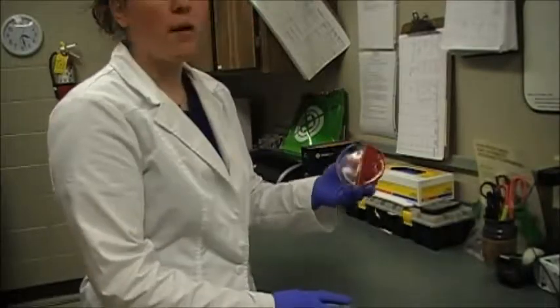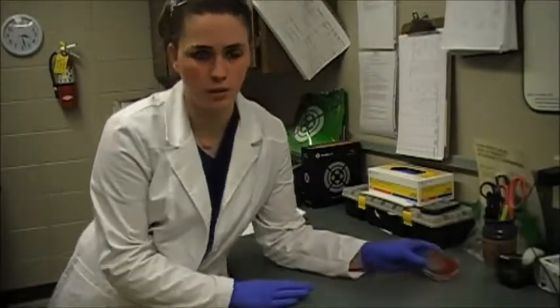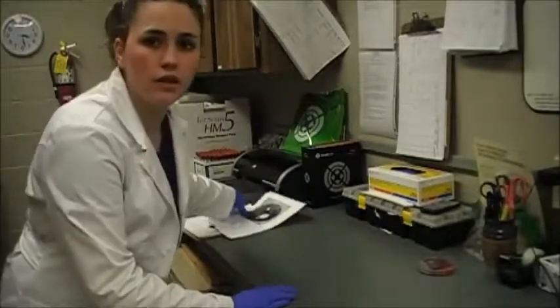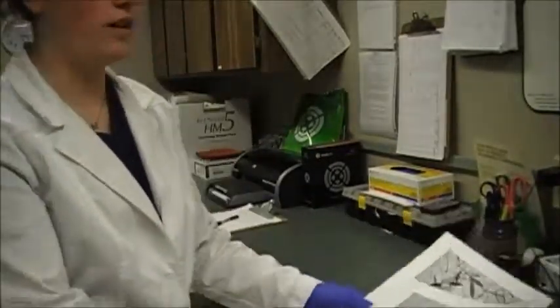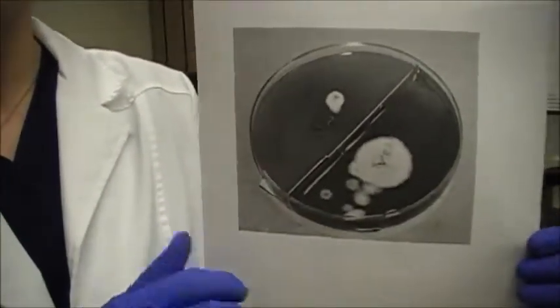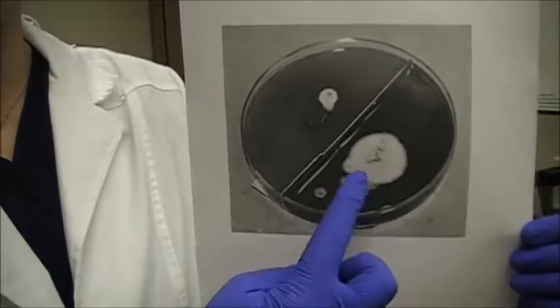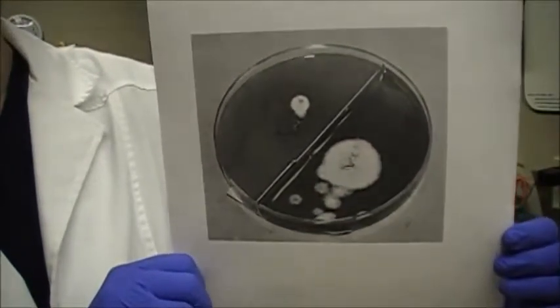If it were to be a positive test, it would be fairly obvious appearing on the medium. Since this has been incubating for several days, we've confirmed that it is not a dermatophyte or ringworm. What we'd be looking for on the test — this is what it would look like in our culture if it were a positive. It's a little harder to see in black and white, but it would appear almost mold-like on our culture if it were positive for ringworm.